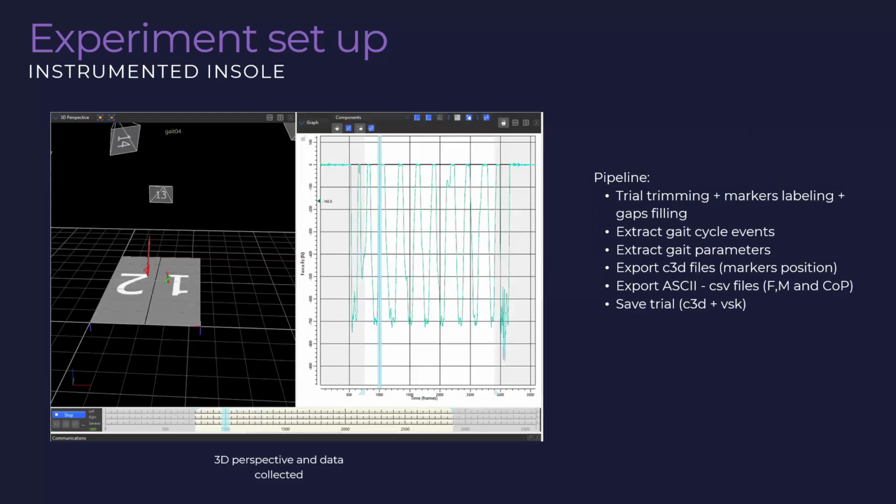But it can be used for a lot of things. It can also be used for measuring compensatory motions. For example, if someone has some muscle weaknesses, they are going to compensate for these weaknesses by doing other motions or involving unwanted motions in just doing a trajectory, for example. So you can record that and see what's added compared to healthy developed subjects.